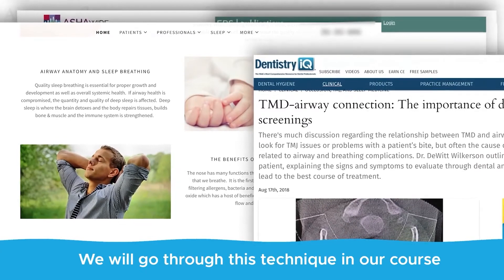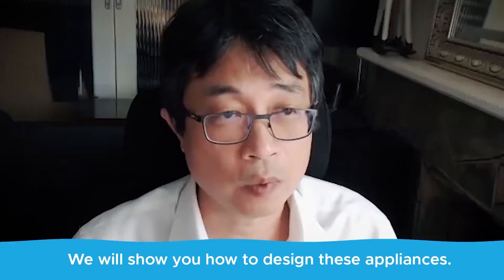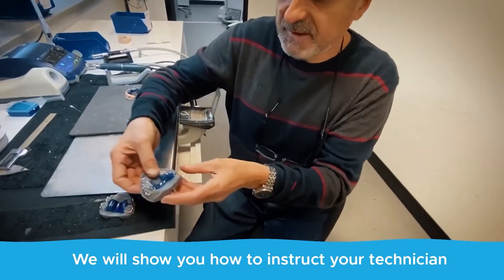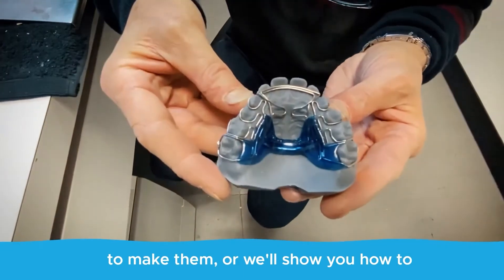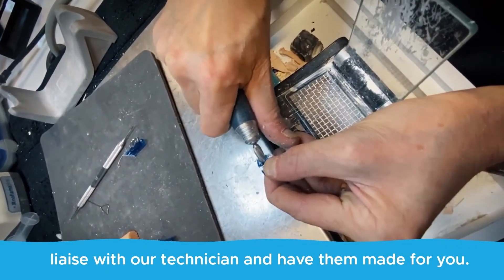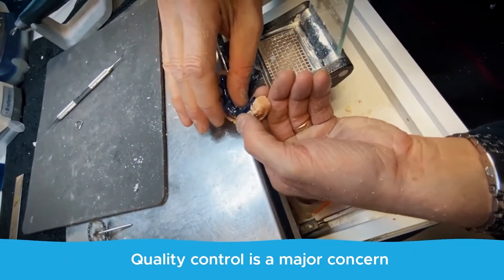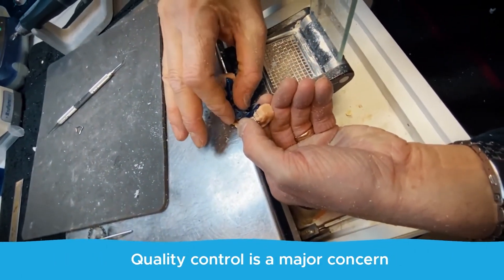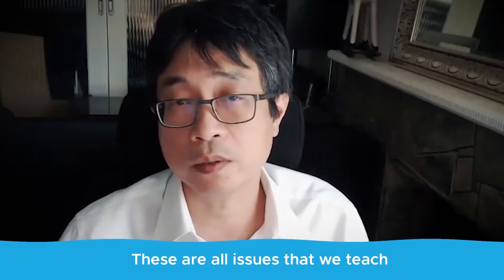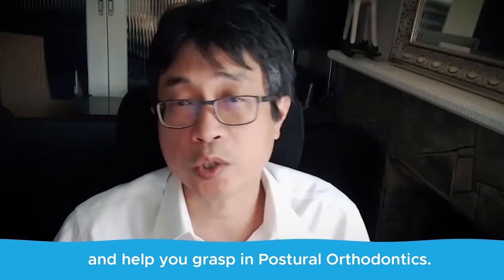We'll go through this technique in our course, Postural Orthodontics. We will show you how to design these appliances, how to instruct your technician to make them, or how to liaise with our technician and have them made for you. Quality control is a major concern for removable appliances — these are all issues that we teach and help you grasp in Postural Orthodontics.